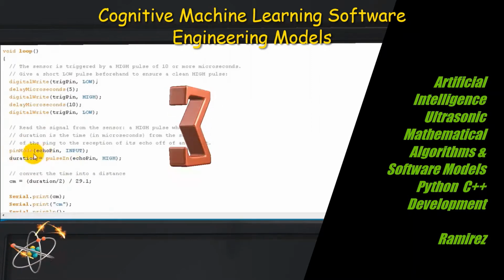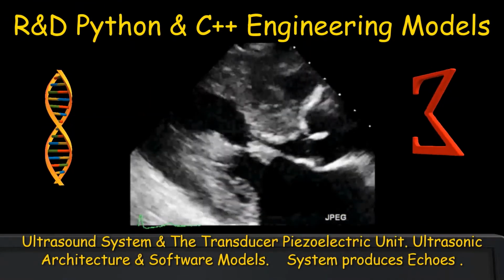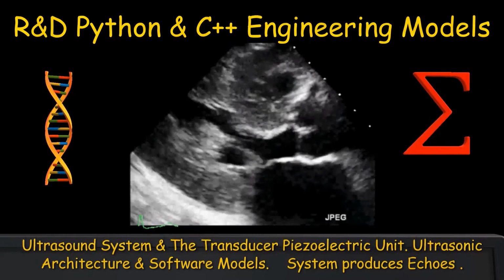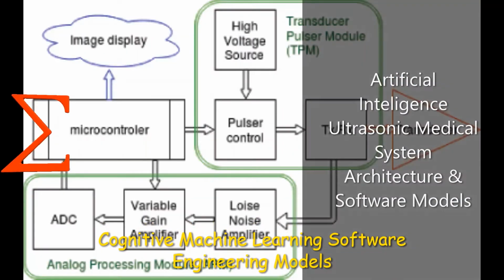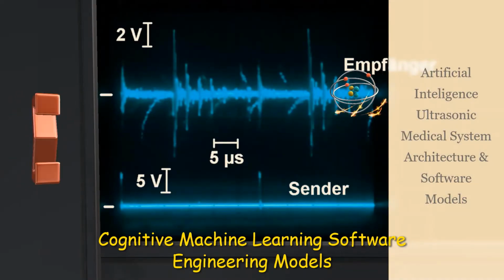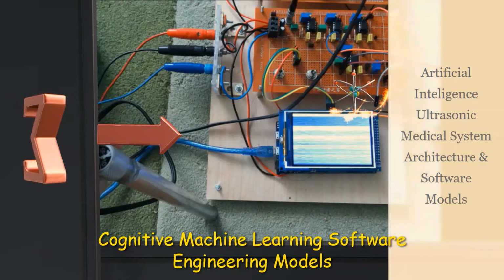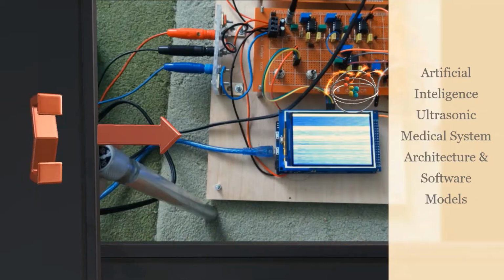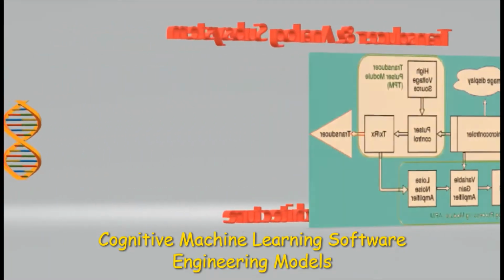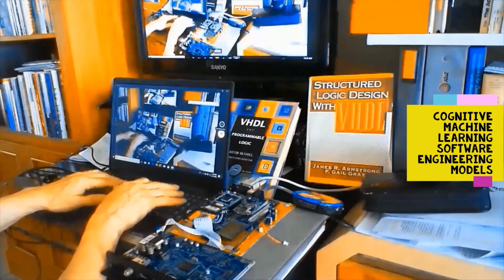Ultrasounds are high-frequency sound waves used in this medical application for diagnosis. Their frequencies can vary from 2 to about 15 megahertz for regular imaging, where in some cases higher frequencies are used for a finer surface image.